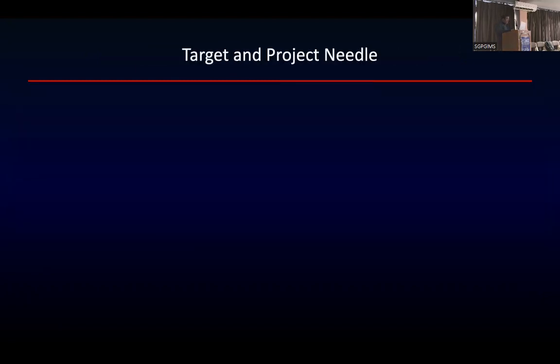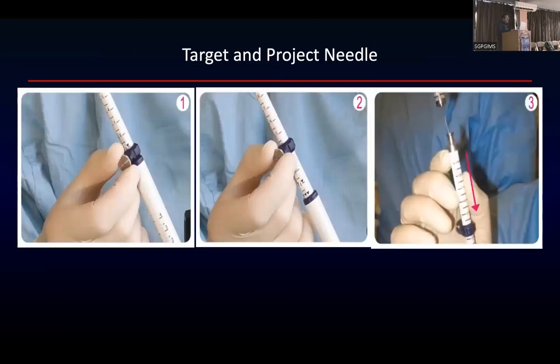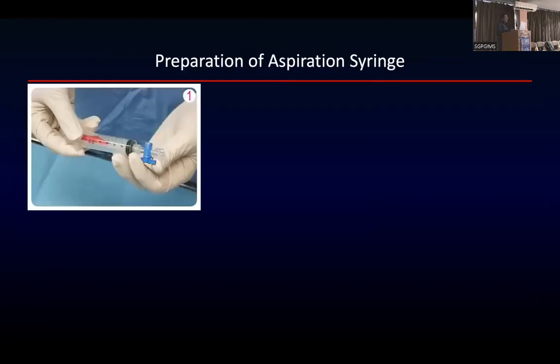So once you have done that, position the lesion in the needle path, target and project the needle. आप length adjust कर रहे हैं, sheath की length आपने adjust कर दी और आपने needle की length adjust कर दी. And then if you are doing suction, so again normally what you do is, now there are studies to tell you that with or without suction it does not make a difference. However, the practical part that I will tell you is that in all passes, we go first without suction. If we don't get sufficient material, we use suction.